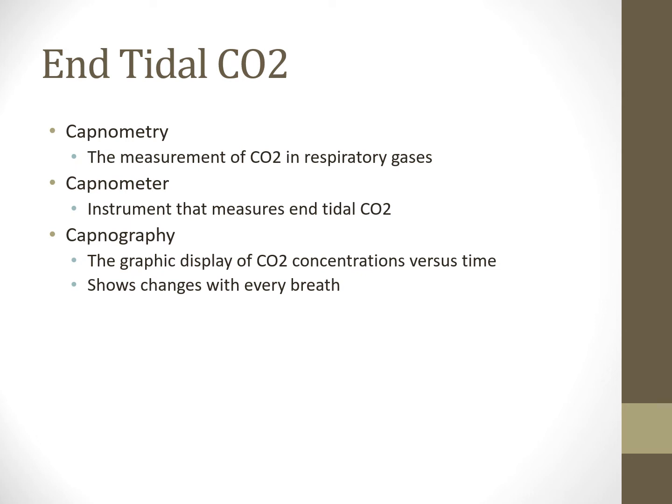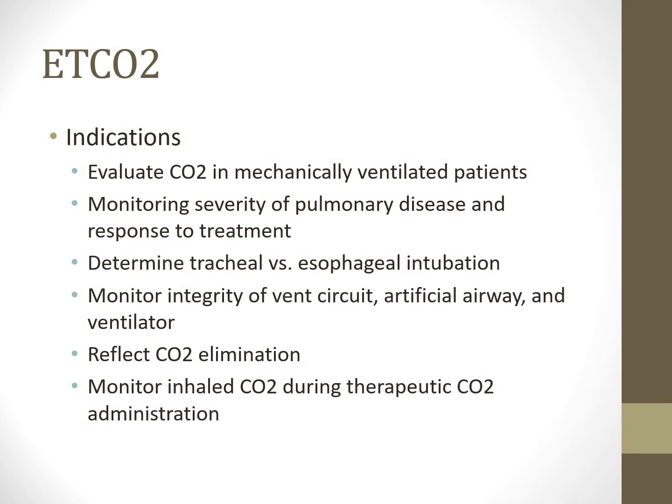Capnometry is the measurement of CO2 in respiratory gases. So that's a definition. A capnometer is the instrument you use to measure CO2. Capnography, so a graph, notice the keyword is graph in there, is a graph display of CO2. So this shows us changes with every breath. Capnography is a very valuable tool in critical care and emergency medicine.